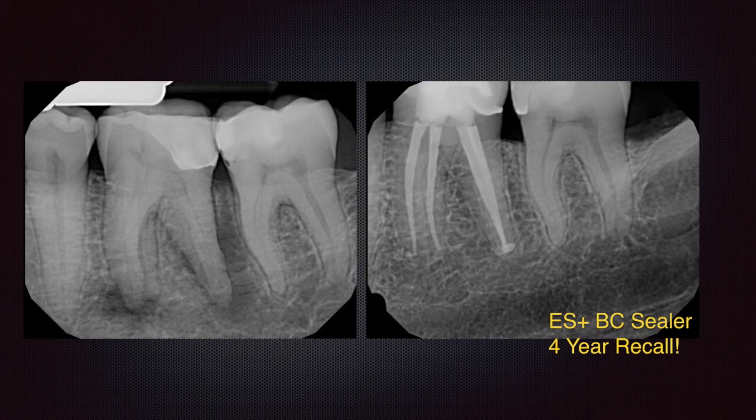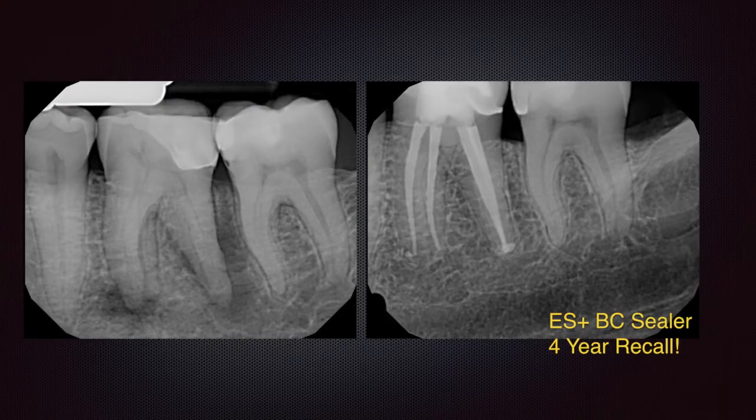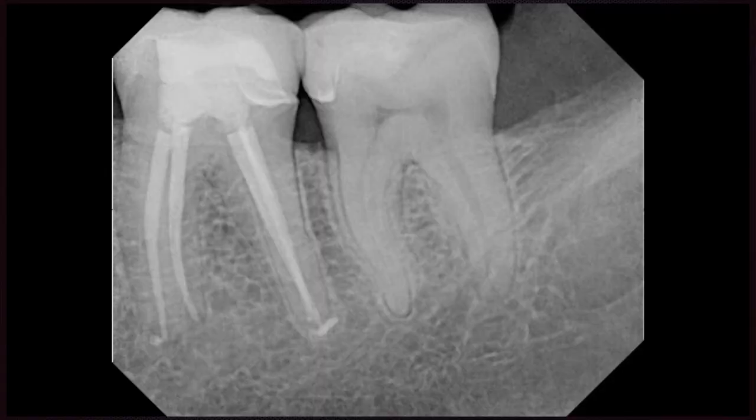And you can see now, 4 years later, this case also gives me some validation for the treatment of these cases, whether it was with the EndoSequence and the bonded obturation, and now we're just changing the protocol using the EndoSequence in a different way and adding the booster tip to it, so we have the ESX file. So I just wanted to share this with you as well, because it immediately gives you a nice validation for the EndoSequence system and the bioceramic bonded obturation technique. We have great healing, as you can see here in this case.